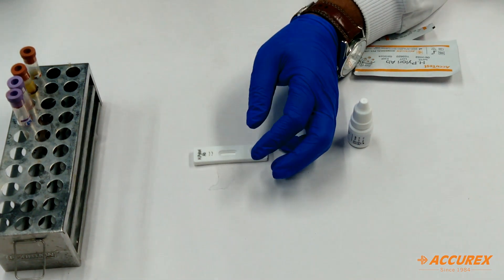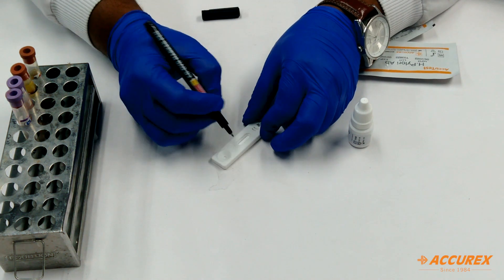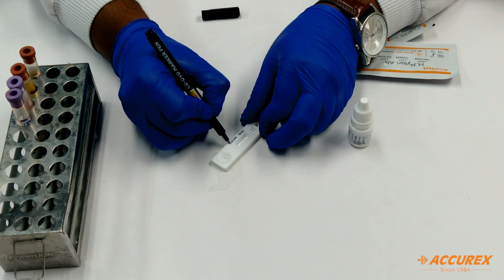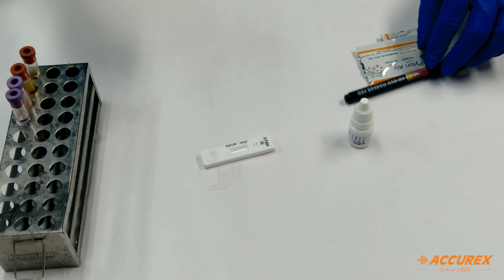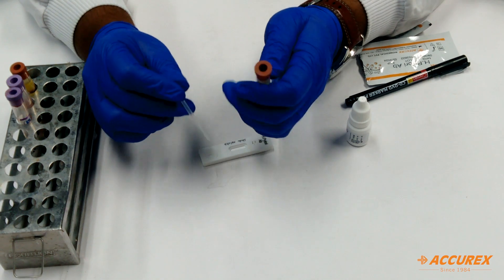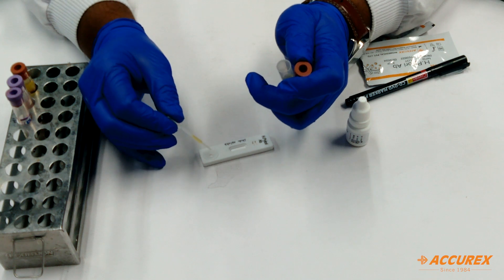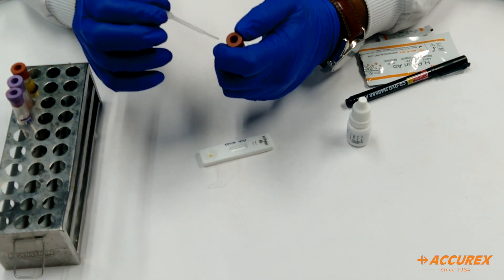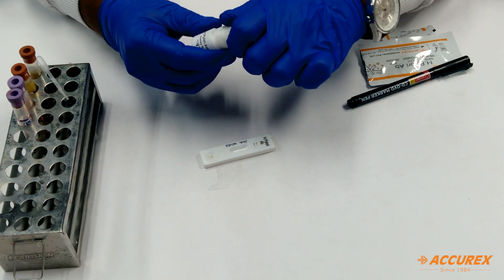Before testing, you need to mention the patient name on the card and the date. For the sample, I have taken a serum sample in a plain tube. We will take one drop of serum sample and add it into the sample well, followed by two drops of buffer.